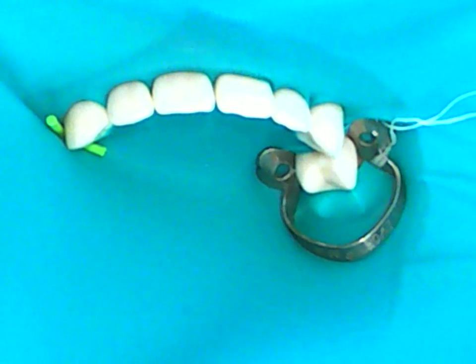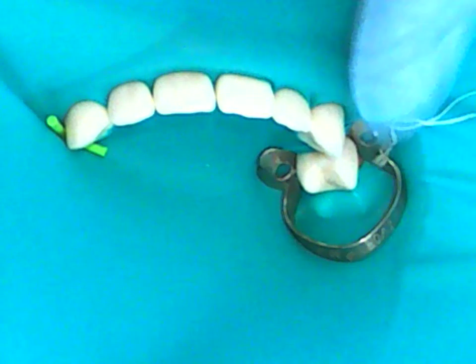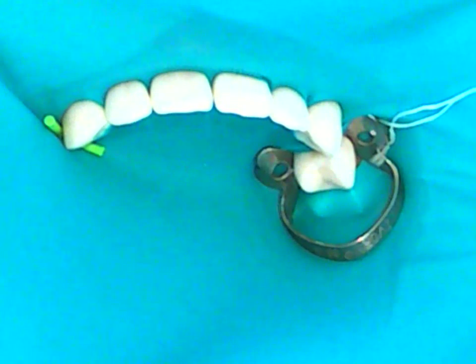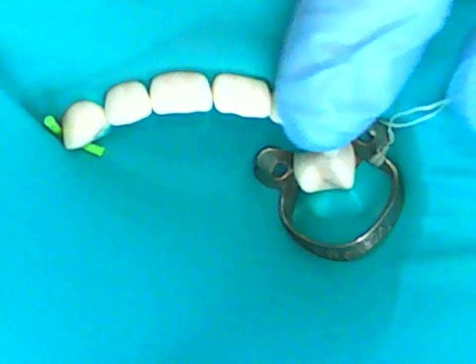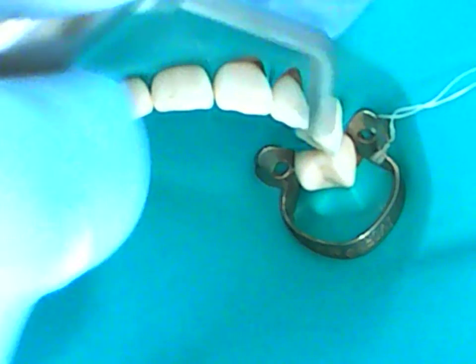Okay, so the ligature is placed. I'm going to go back to inversion. I know I've done the mesial and distal aspects. I'm going to concentrate on the facial and lingual, and these all look inverted. If I feel there's one or two areas that did not invert with flossing, I will use my air first. So you're going to retract.